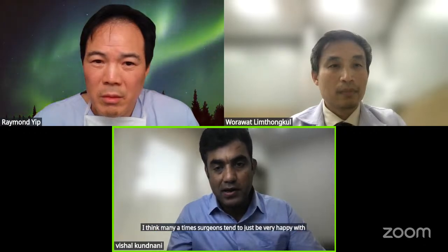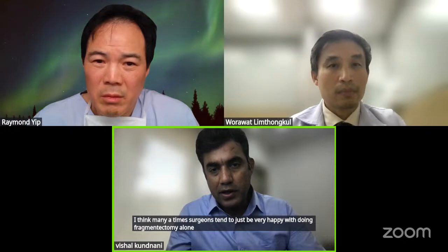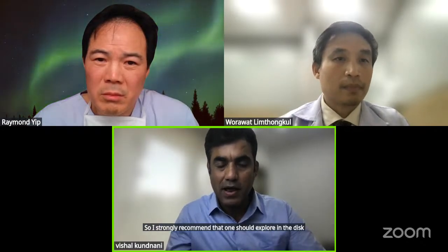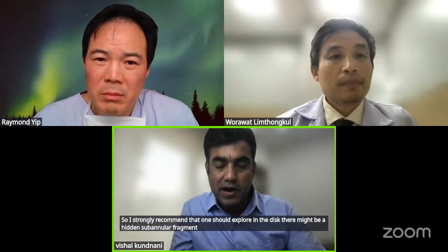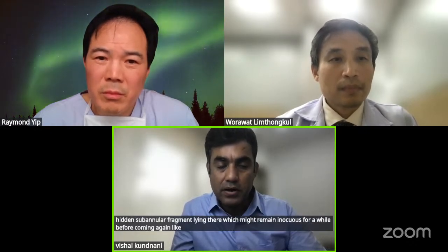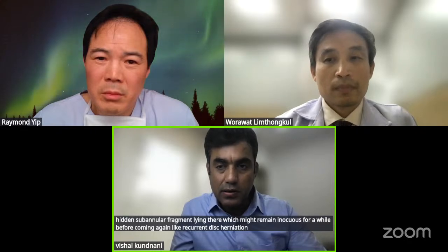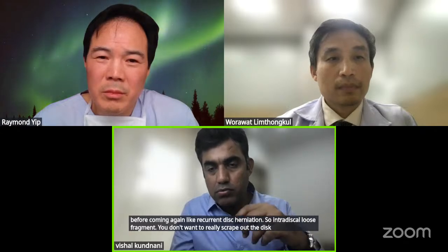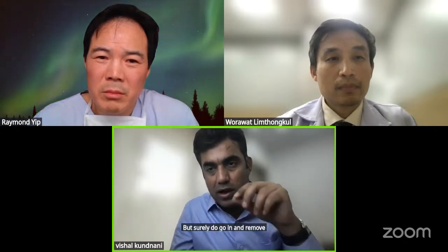I think many times surgeons tend to be very happy with doing fragmentectomy alone, and they don't explore the disc. I strongly recommend that one should explore the disc. There might be a hidden subannular fragment lying there, which might remain innocuous for a while before coming back again, like a recurrent disc herniation. So for an intradiscal loose fragment, you don't want to really scrape out the disc, but do go in and remove it with non-tooth disc punches.